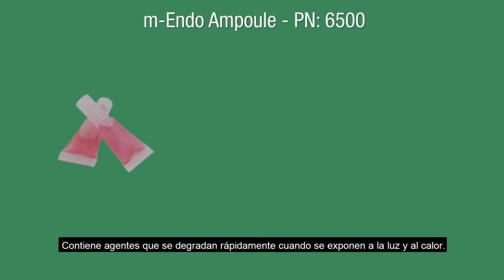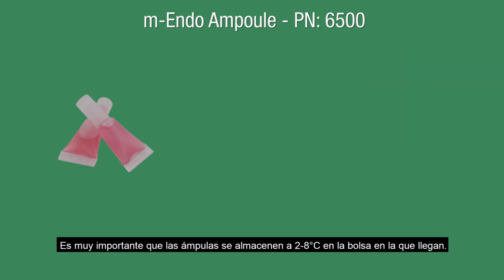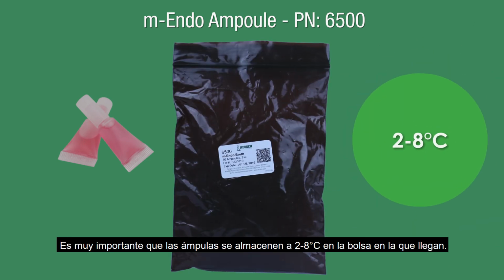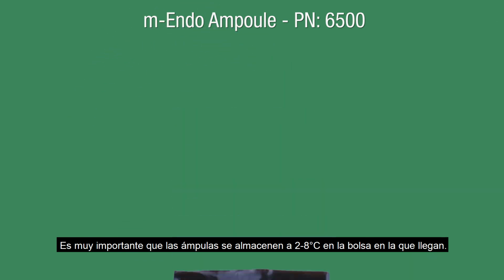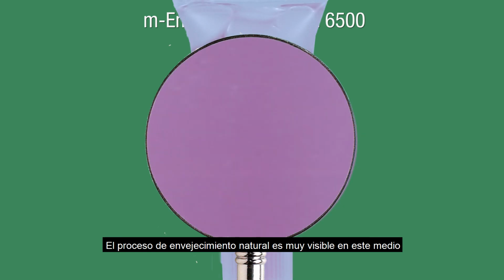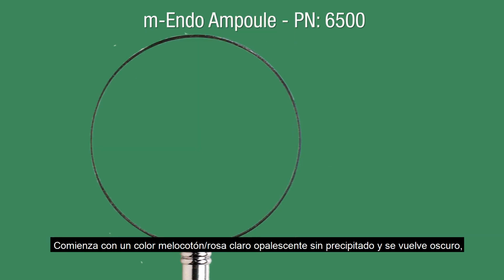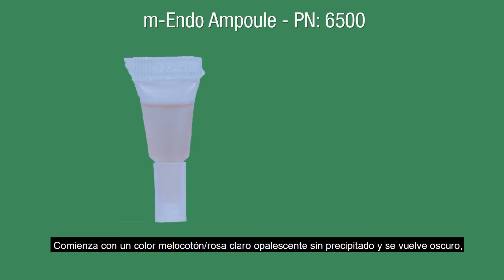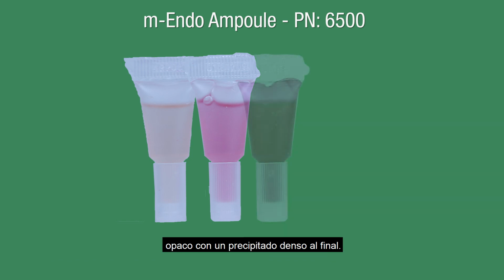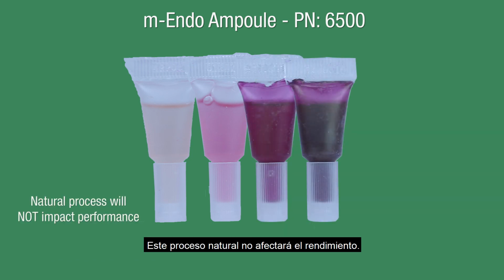It contains agents that degrade quickly when exposed to light and heat. It is very important that the ampules are stored at 2 to 8 degrees Celsius in the bag they arrive in. The natural aging process is very visible in this media, and it will change color throughout its shelf life. It starts off opalescent, light peach pink, with no precipitate, and becomes dark, opaque fuchsia with a heavy precipitate by the end. This natural process will not impact performance.